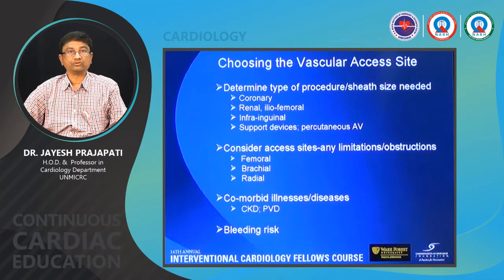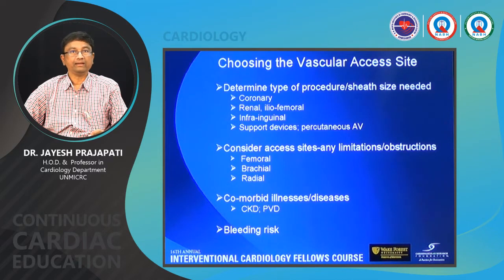So each and every person should have experience of all the accesses. One should not be dead. Nowadays most of the people are moving toward the radial. So the fellows who are trained in radial, what happened, femoral is like a highway. You find some major complication occur, we require IABP, we are doing some peripheral interventions, even the patient requires support with large bore devices. So experience of the femoral should also be there. Everyone should be trained in each and every access for the benefit of the patients.